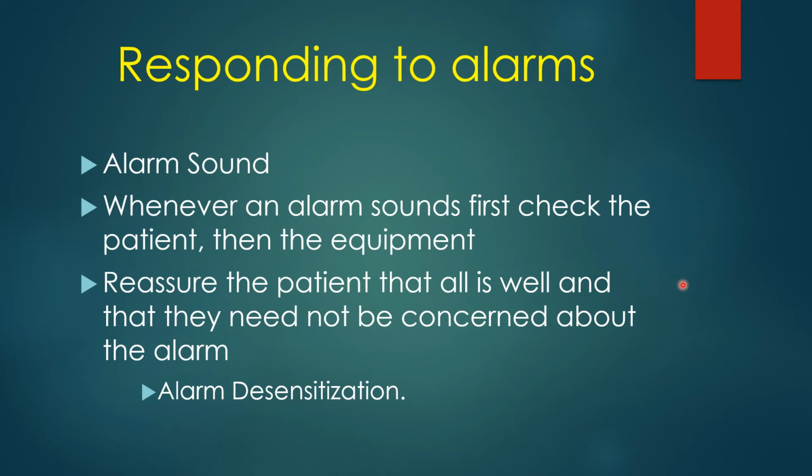So just take a minute to reassure the patient that the ventilator is very sensitive and has a whole bunch of alarms on it that go off for nothing serious, and that he should not be concerned about the alarms, that we are paying attention to it.